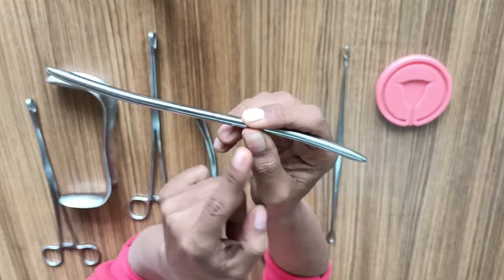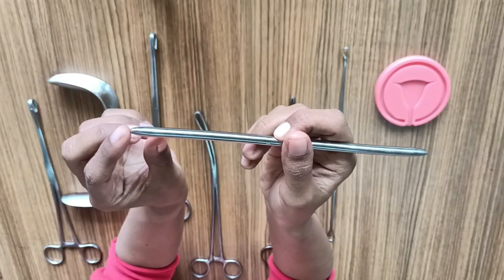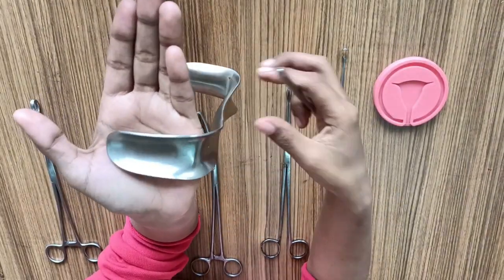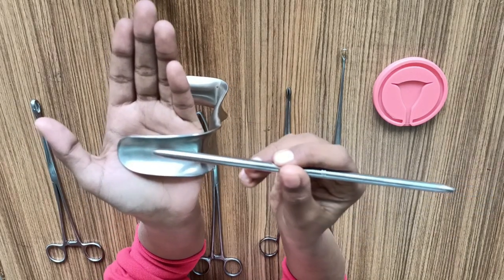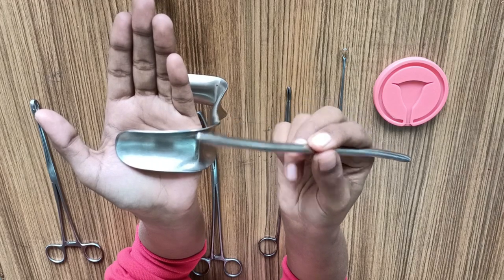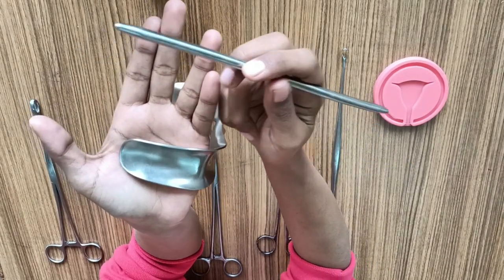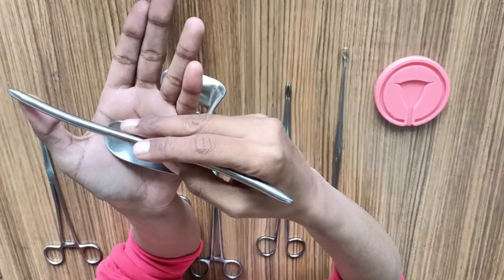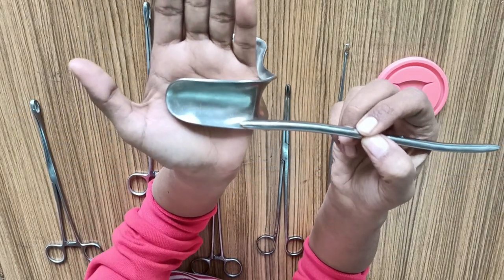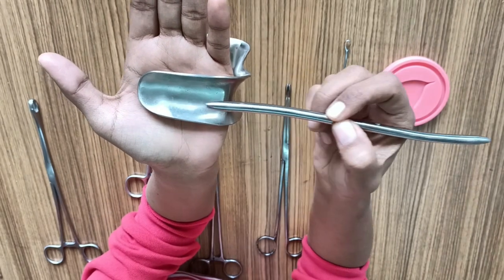The size is mentioned in the middle of the dilator and varies from 3 mm to 18 mm. Only a small portion of the dilator is required to dilate the cervical canal. After introduction of the Sims speculum and vulsellum, holding the cervix adequately and visualizing the external os, introduce the dilator and dilate the cervical canal gradually and slowly, beginning from a small size and going towards the bigger one. Hold the dilator in a pen-shaped fashion with thumb, index and middle finger, while the ring and little finger remain outside the vagina to act as a guard and prevent perforation.